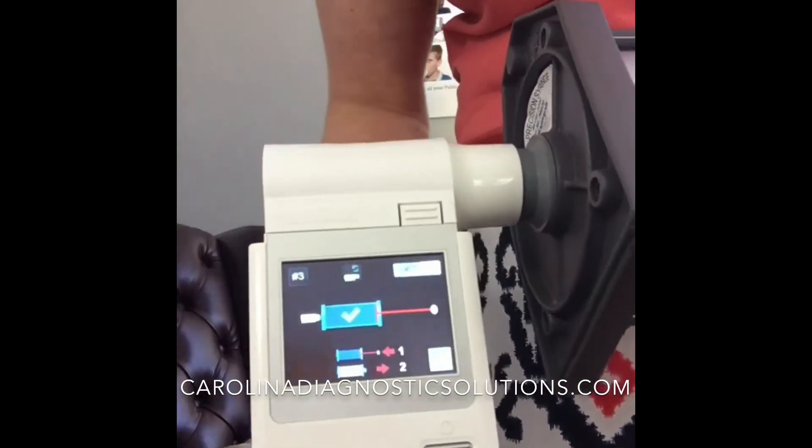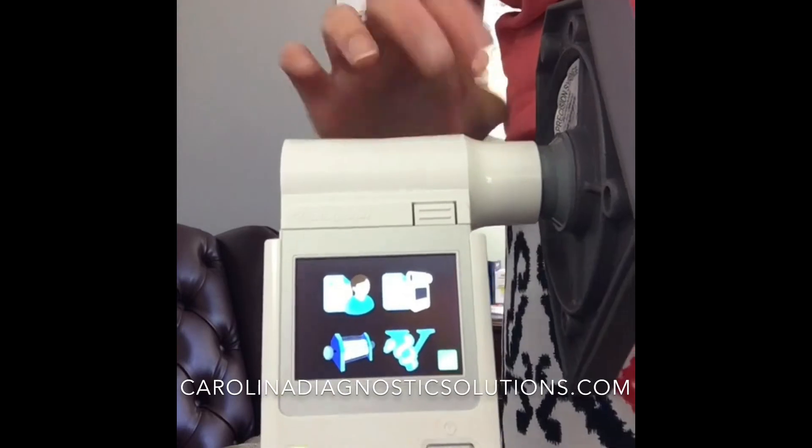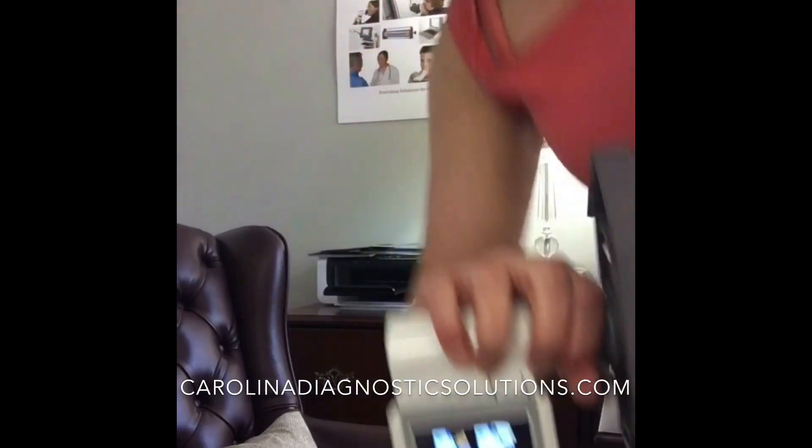You can hit this button right here, which takes you back to the main screen. Your information is saved in your device, which can be uploaded into your Vitalograph reports. Thanks, you all have a good one.